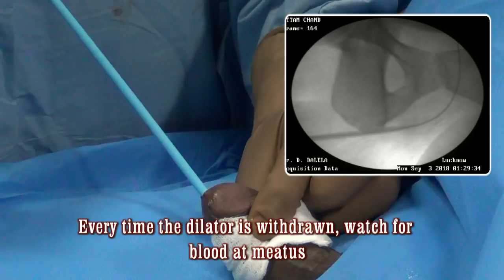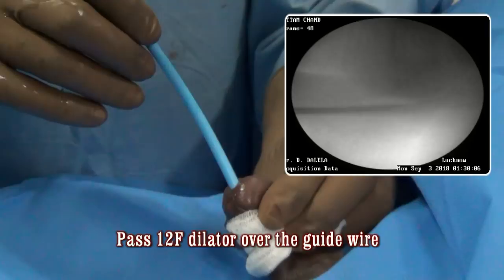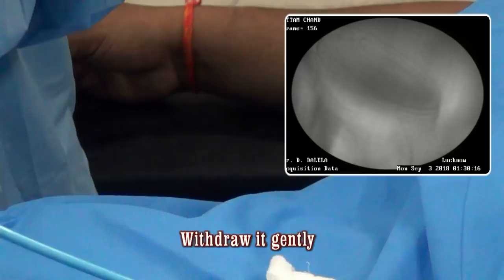Then pass the third dilator — you will appreciate that we are increasing the caliber sequentially: from 8 French to 10 French to 12 French. That is why this is called sequential dilatation. When you insert the dilator into the bladder, remember not to over-insert it.